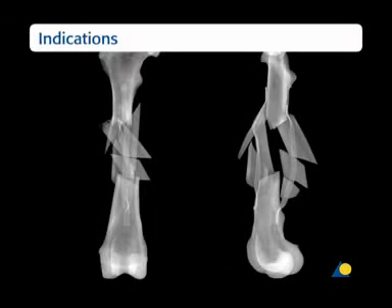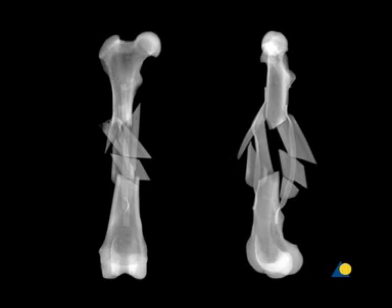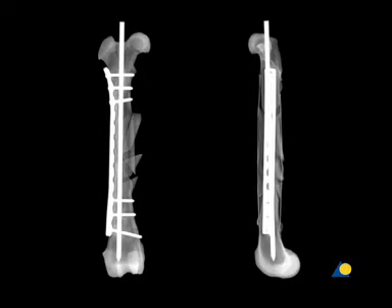These preoperative radiographs of the model show the extent of the comminuted fracture of the femoral shaft. As the proximal and distal segments are not affected, an intramedullary pin can be used to restore axial alignment and the original length of the bone. The plate will protect the fracture from axial compression, as well as rotational and bending forces. The intramedullary pin provides additional resistance to these bending forces.